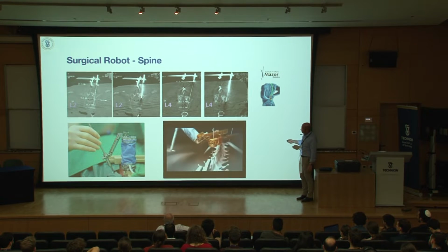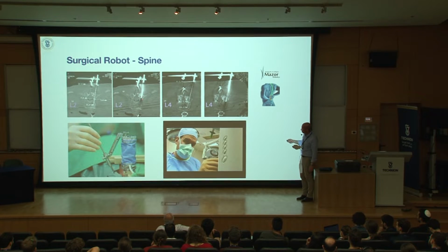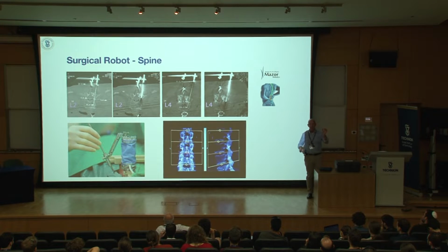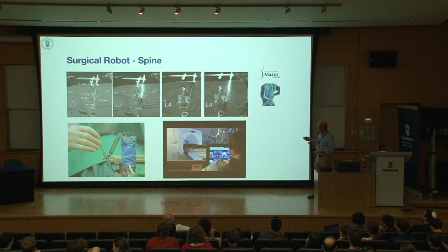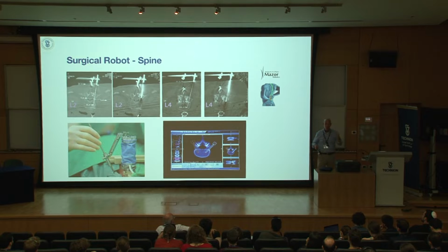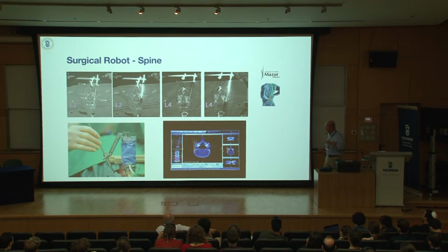Here you can see a CT of the vertebra, and the robot is attached here, and it's putting the screws here. For those mechanical engineers, the tolerance there is less than 1 millimeter. And the consequence of putting the screws not accurately is just penetrating this area, which is the spinal cord. According to literature, 10% of the screws will get into the spinal cord. The minimal amount of screws you put in a surgery is 6.